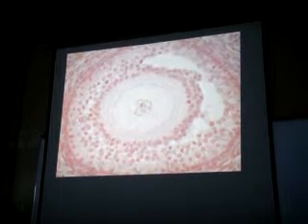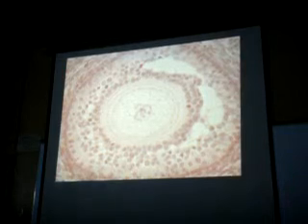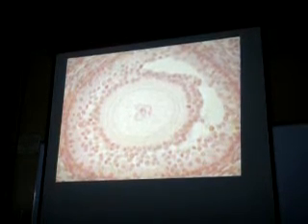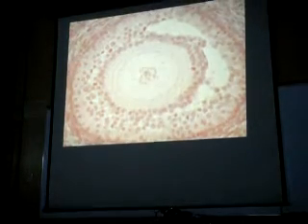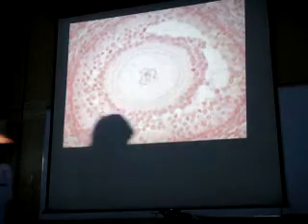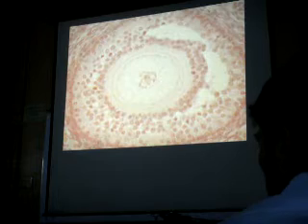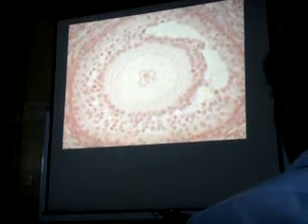So, classify pointed tissue. Be specific. So remember, you have three types of cells according to shape: squamous cells, cuboidal cells, and columnar cells. So how would you differentiate one from the other? If it's squamous cell, it's fusiform or spindle in shape. The nucleus is spherical and it's centrally located. So the middle is wide and both ends are what? Tapered. So for cuboidal, it's understandable, right? All the sides more or less are equal.